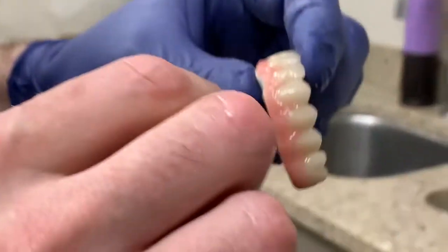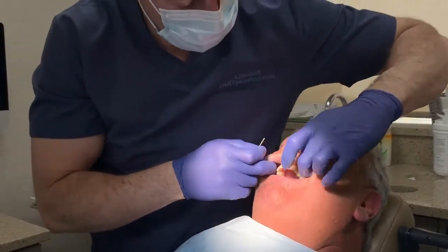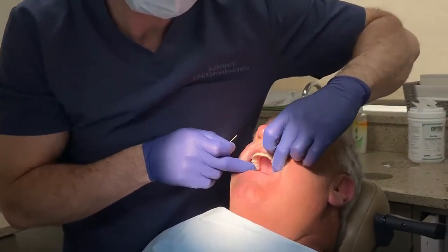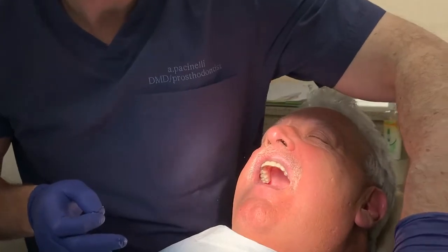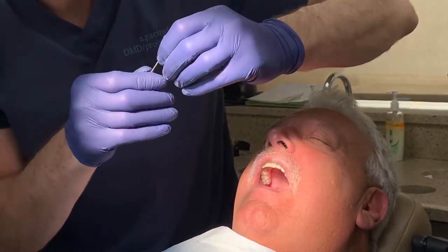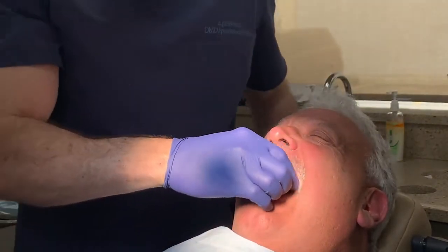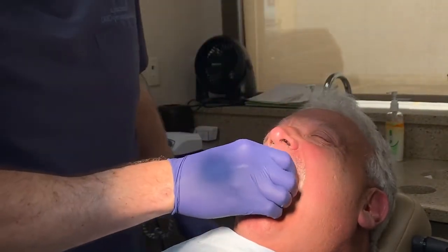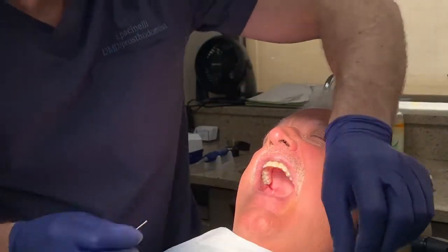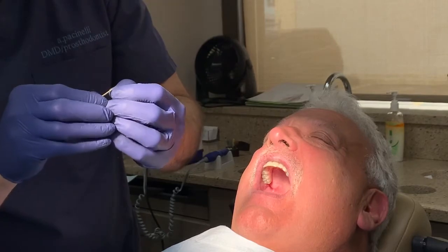Yeah, so I gotta make this look nicer. You see? Hold on. See, that's better now. Do you have a workflow in your mind about opposing arches? Crown and bridge, use zirconium; crown and bridge, use nanoceramic. That's good. Denture teeth, use whatever you want. Like natural teeth, don't use zirconia.